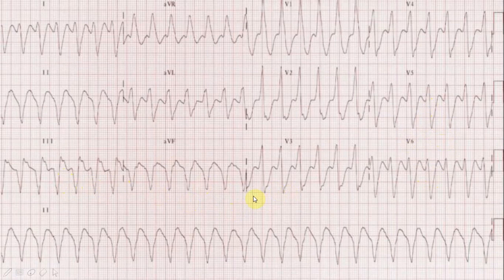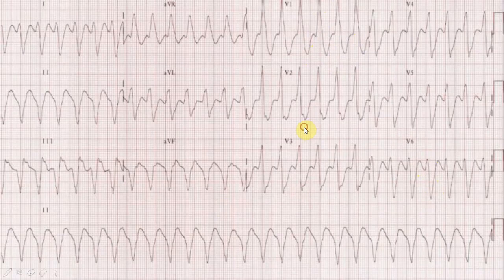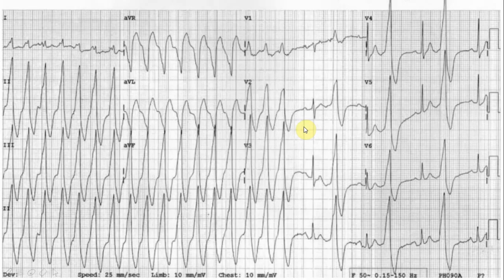Looking at morphological characteristics: in V1 there is a big R and small S so the RS ratio is more than 1; in V6 there is a small r and big S so the RS ratio is less than 1 — classic VT morphology.